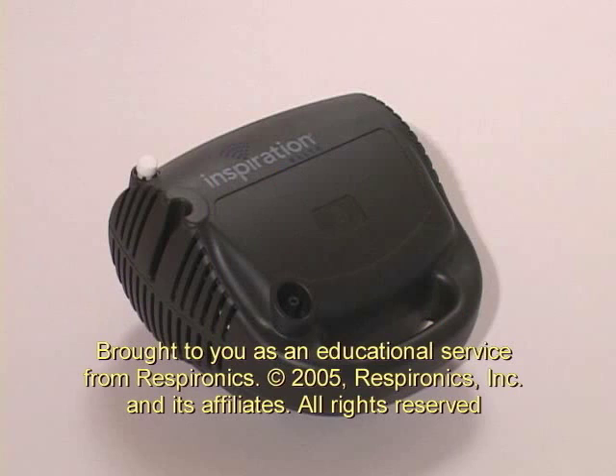We hope this video has helped simplify the steps to taking your medications. Now that you've completed your nebulizer treatment, we hope you will enjoy your day.